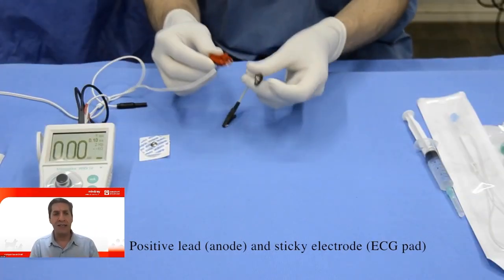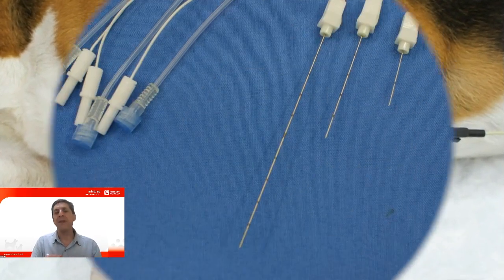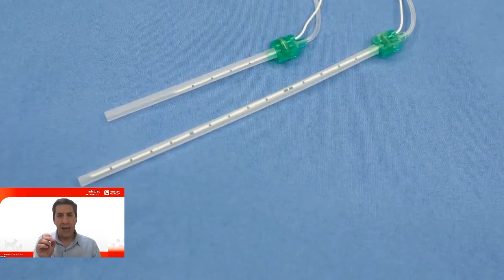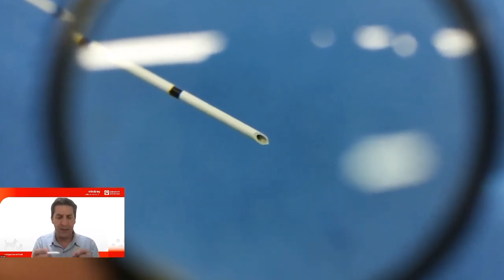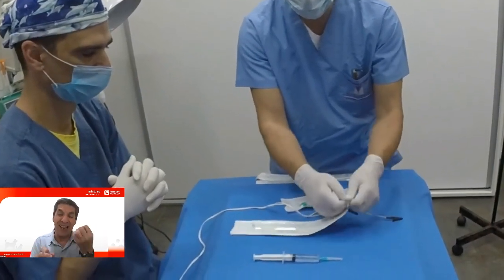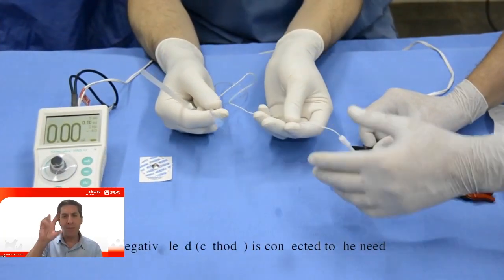The nerve stimulator is a device that allows us to send a current to the needle. The current has, of course, specificities that give us feedback about the distance between the tip of the needle and the nerve. Of course, the nerve we look for should have motor fibers because this electricity will promote myoclonus.